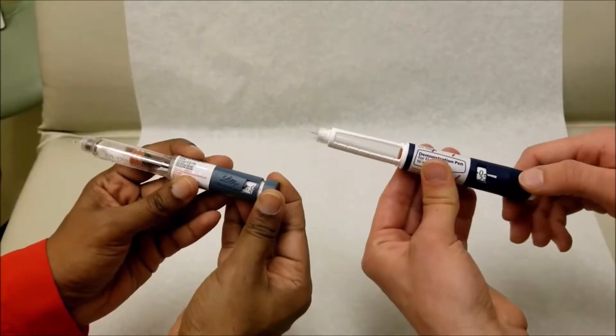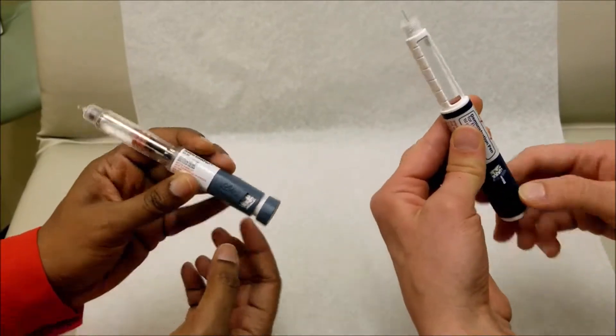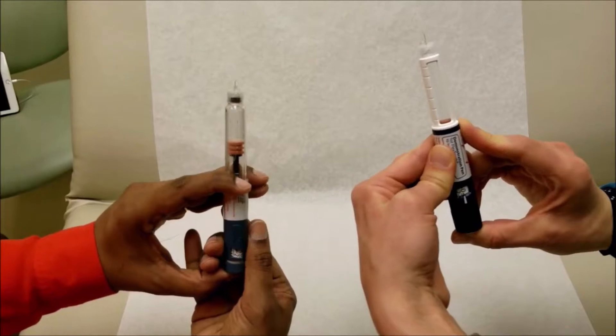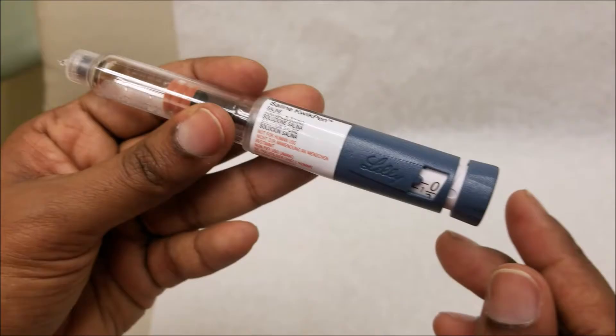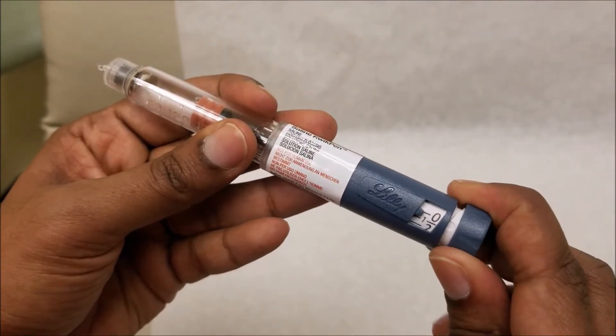Prime your pen by dialing up your dose to two units, and then holding it in front of you, press it down to zero, and see that liquid came out of the needle. Once you've primed your pen, the next step would be to dial up your dose.